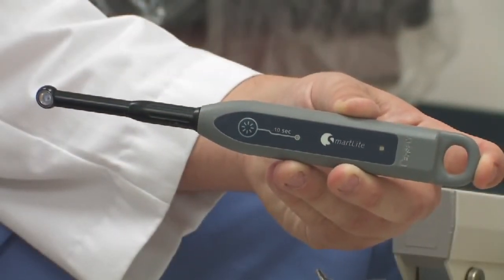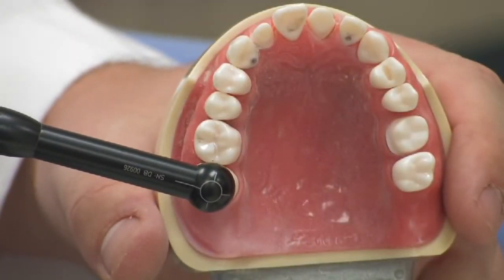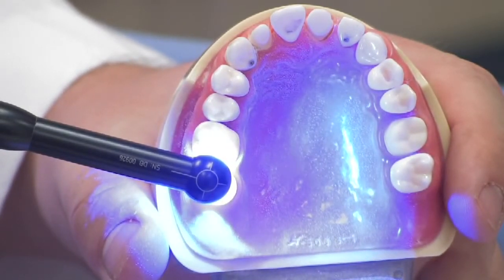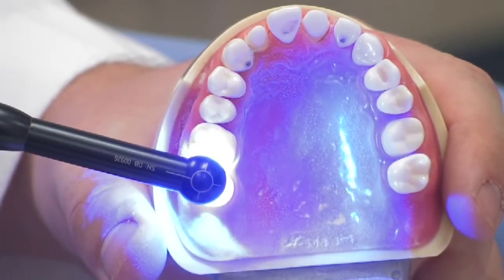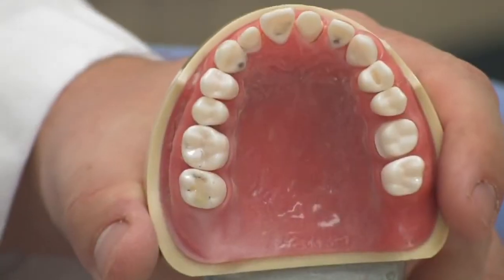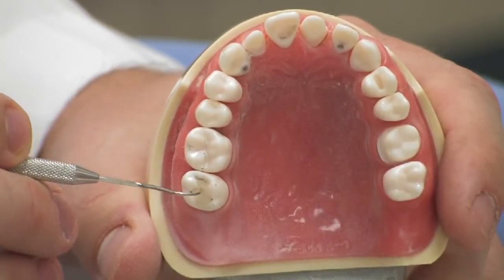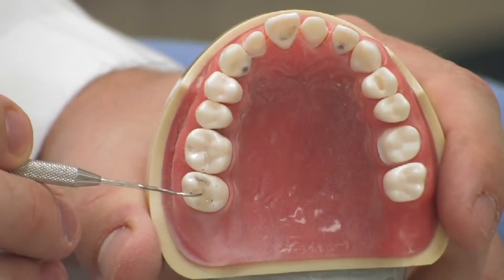We'll put our light over top of the tooth that we did the filling on, and by activating a small button, we initiate a light reaction that makes the material really hard. That typically takes anywhere from about 20 to 30 seconds, depending on how big the cavity was and how thick the filling would be. Once that process has been completed, the dentist will go back and check the filling to make sure that it's set up and it's hard. So what started out as very soft is now very hard with the curing light.